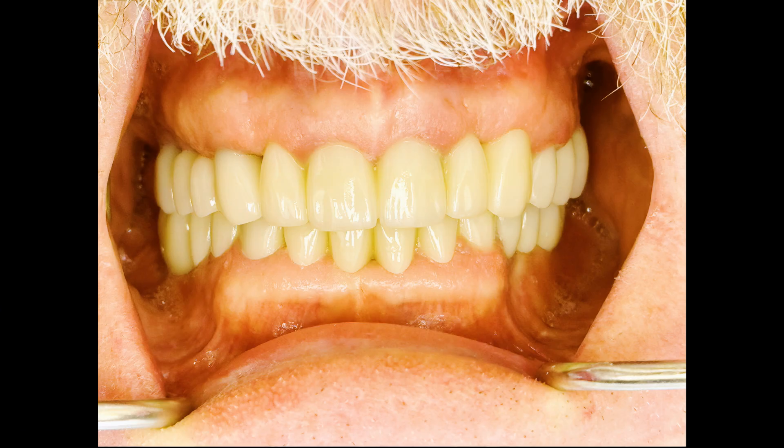First of all, if you look at the picture of him there smiling, that's a beautiful natural-looking smile. I don't think that anybody looking at the smile would guess that those aren't his teeth. It looks really beautiful and natural. But what's even better is that if you pull back his lips and you look inside of his mouth, it's still really hard to tell that they aren't his teeth.